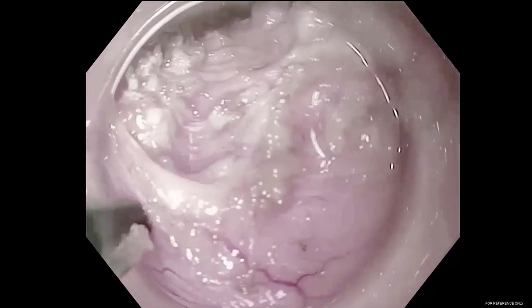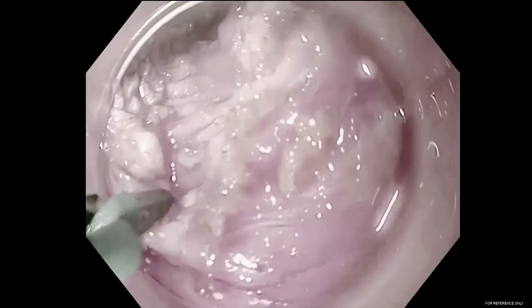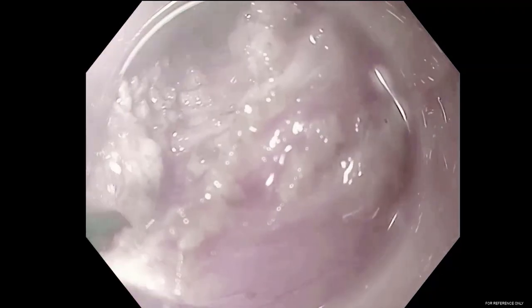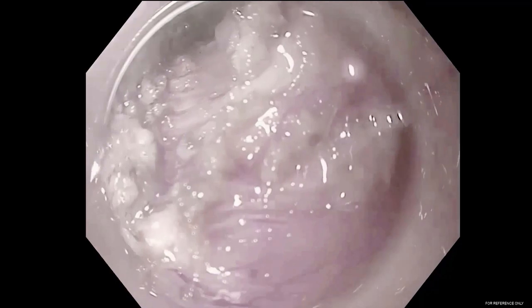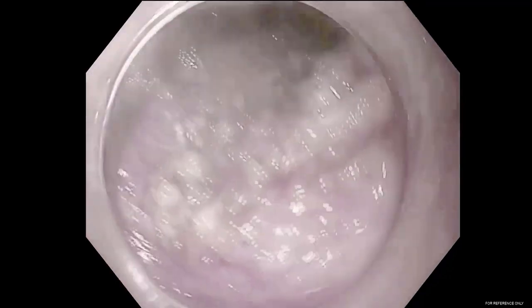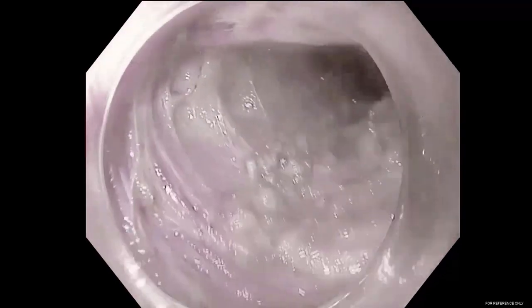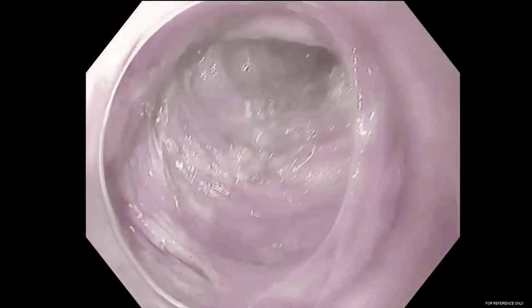At this point, we are cutting the last fiber, as seen in the video. We performed a circular layer myotomy and not a full thickness myotomy. After the complete dissection, we proceed to the last step, which is closing the wall defect created by the tunneling.